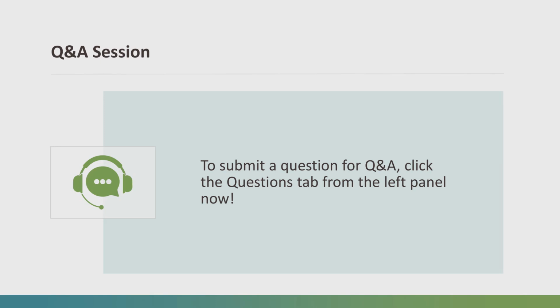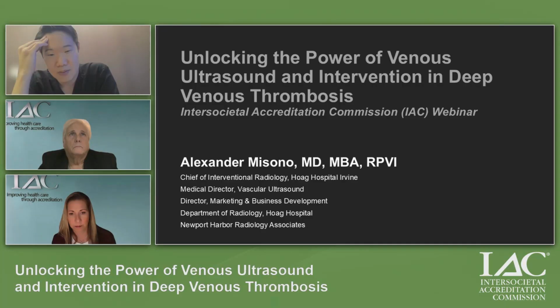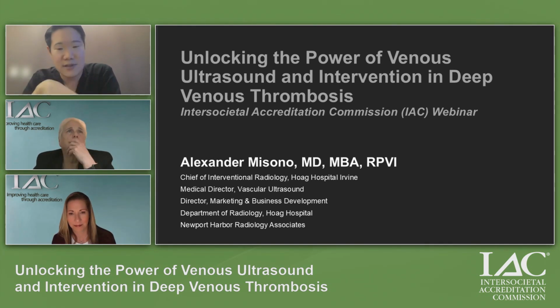So I think there is the diagnostic side of things where you have to follow the rule book as to what's a DVT and what's not a DVT. But from an interventional perspective, I think much more mechanistically as to what's a significant DVT, what's a DVT that's going to cause a lot of potentially debilitating or maybe even irreversible thrombotic burden for the patient. So I'm not sure if that exactly answers the question, but I don't have a centimeter marking so much. I'm thinking very mechanistically and physiologically as it relates to my patients.